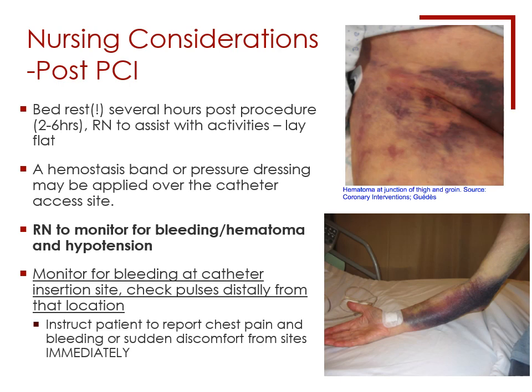Now you need to also monitor for bleeding when they get back, because most people aren't bleeding, but if they walk too soon, they will start bleeding again. So you need to make sure that you are holding pressure on that site. The other thing you need to check for is those pulses. Remember, we looked at those pulses before we went into the artery. Now we've closed it off.